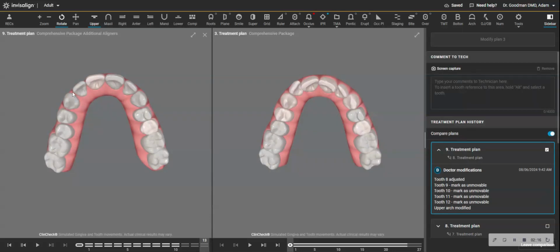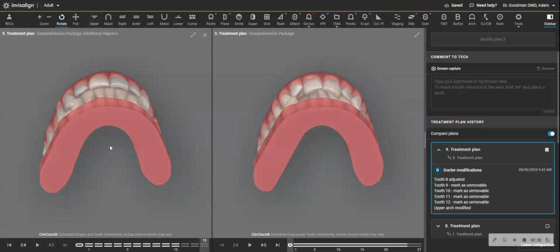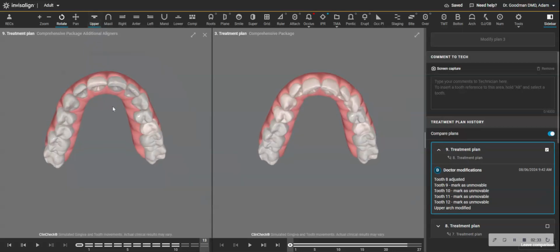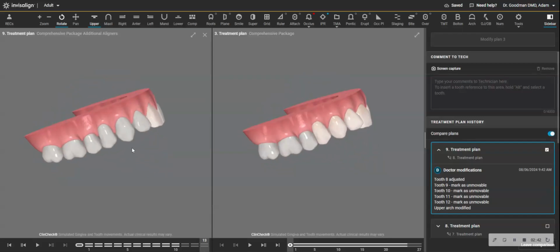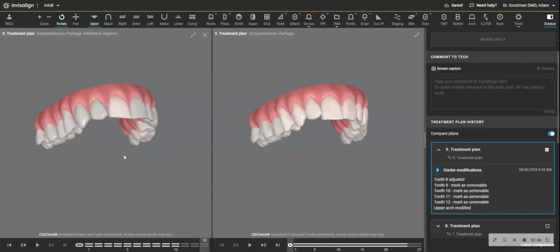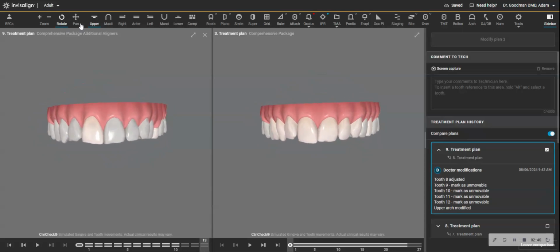And notice how there's some space here, here, and here. Now, this patient was explained to by me from the start that there would be some space left over, because if I try to close this space, I will further constrict the arch and it won't fit with the lower, because here's where she is now. And so you can plan this out ahead of time and communicate with the patient. She might leave these spaces, she's keeping them clean, or she might get a new crown on this narrow premolar over here. She might even do veneers on her upper front teeth.